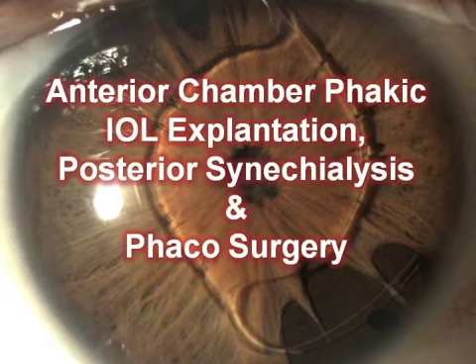Anterior chamber phakic intraocular lens explantation, posterior synechialysis, and phaco surgery.